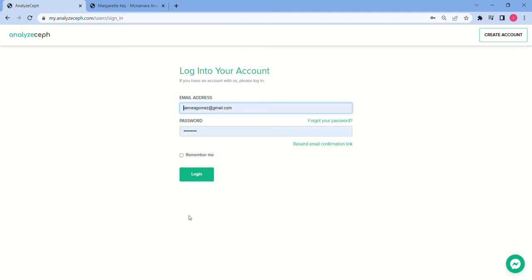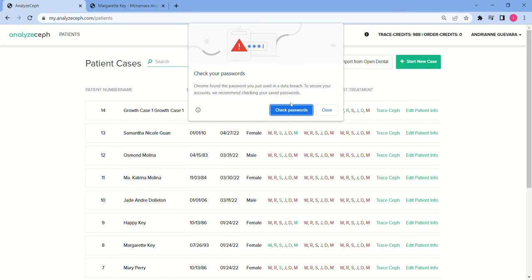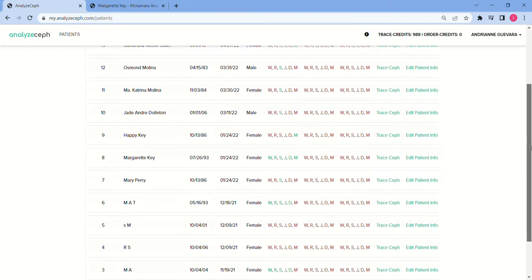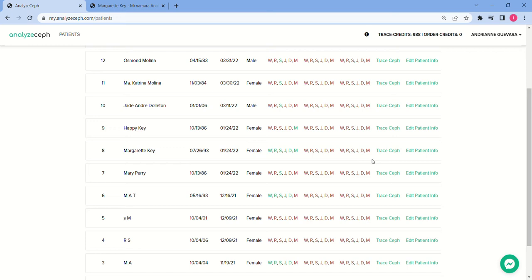Today I'm going to show you how to do the McNamara analysis using Analyzef. First, log into your account and on your main screen, select the case that needs the analysis. For today we're doing patient number eight.